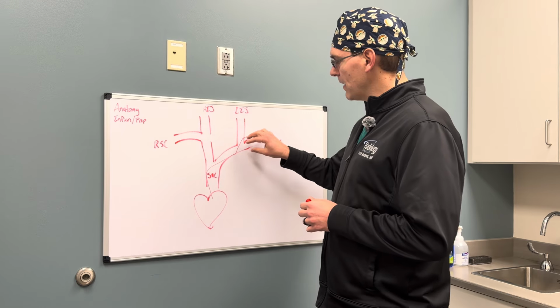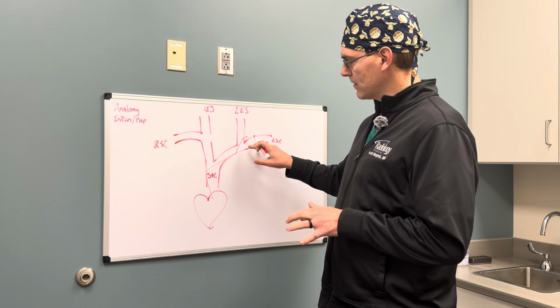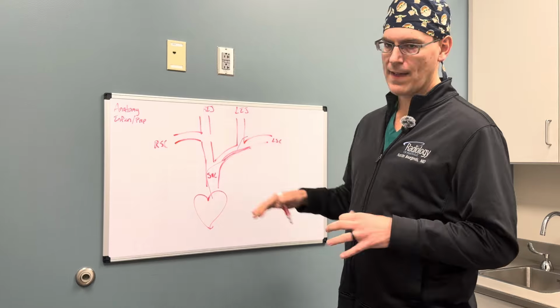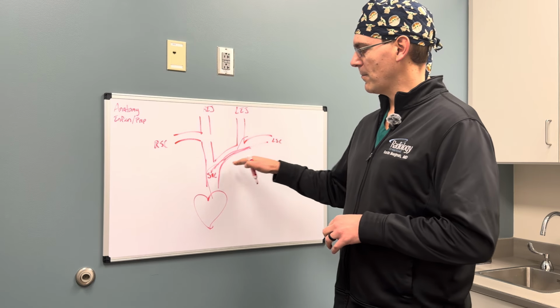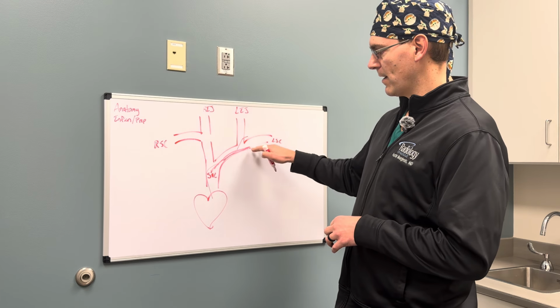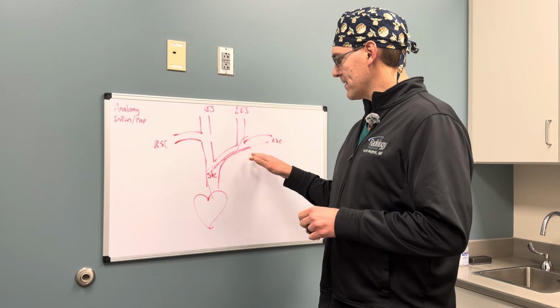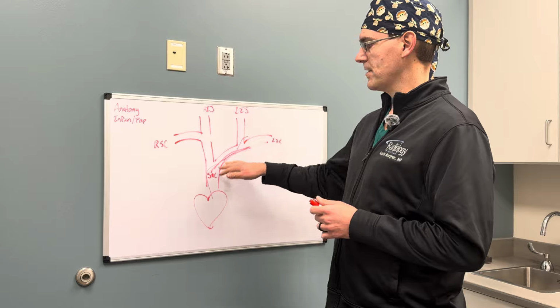And so this can be a problem long-term from the left. For example, we see a lot of left subclavian ports, and you can imagine this left subclavian access is the worst chest central vein access, because you have this long area of contact with the left brachiocephalic and subclavian veins. And then many surgeons will put the port catheter too short. So we end up with this phenomenon of the surgical port being left subclavian, having prolonged contact with the brachiocephalic and subclavian veins, and then the tip is chronically in contact with the SVC. And this results in a central vein occlusion. And so left subclavian access is probably the least preferred access and can result in occlusions in areas of narrowing.